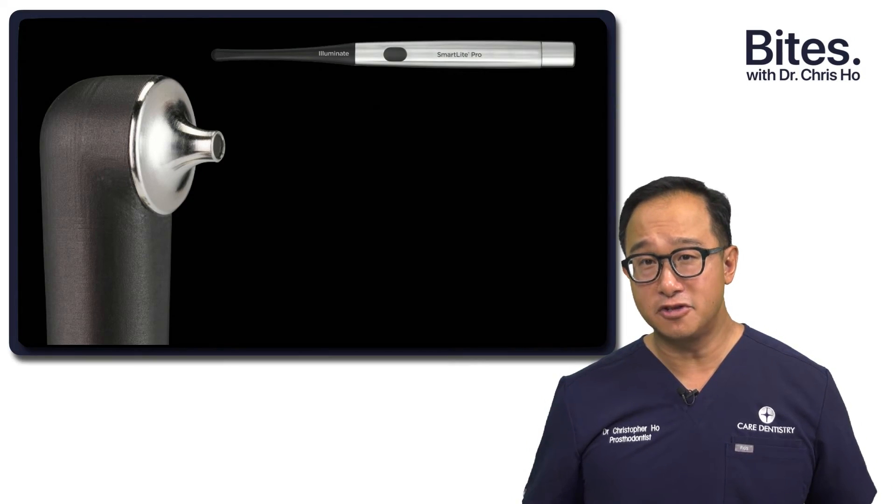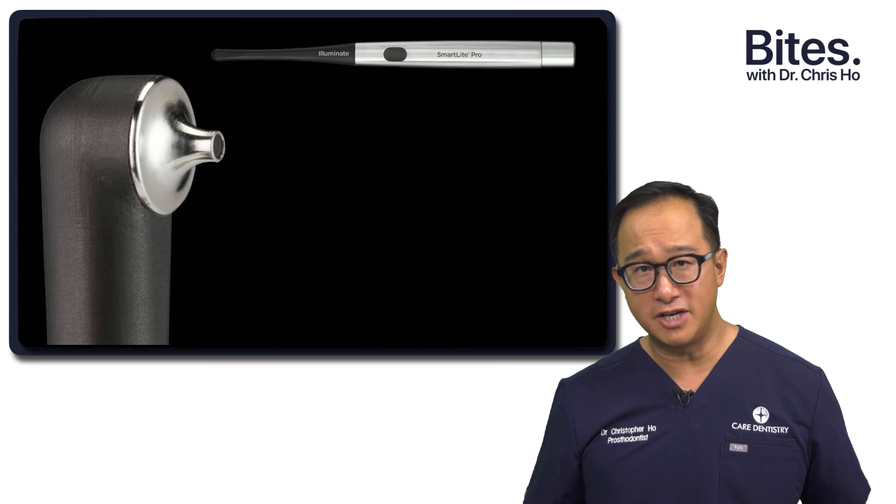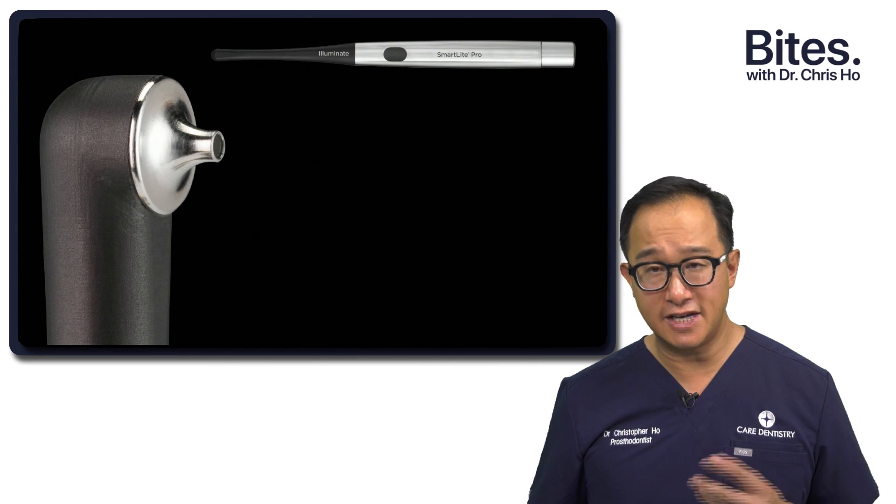So if you're in the market for a curing light, it's worthwhile looking at this Smart Light Pro. This ergonomic design, this pen-style grip, and it being lightweight, along with the feature of trans-illumination — it's definitely worth having a look at.